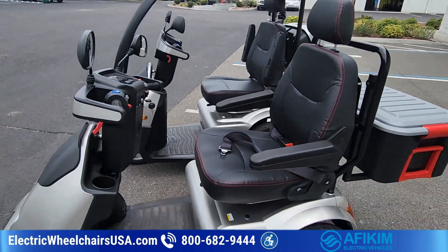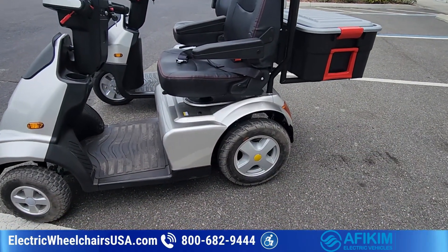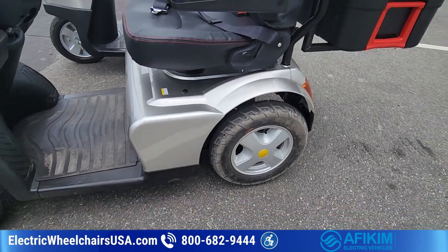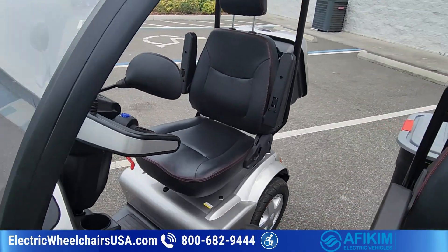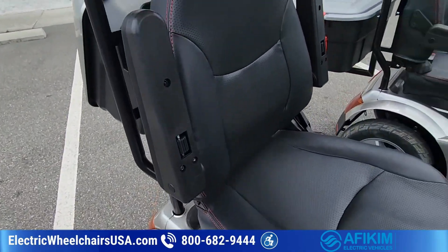Going over the features quickly — these apply to both models. Both scooters have a 500-pound weight capacity, but you can add a heavy-duty suspension to the S4, which increases the weight capacity to 600 pounds. You cannot add a heavy-duty suspension to the S3 due to its three-wheel configuration, so that's something to keep in mind.